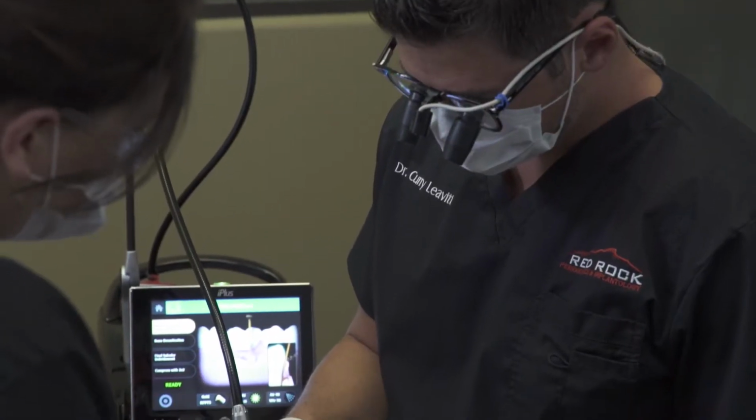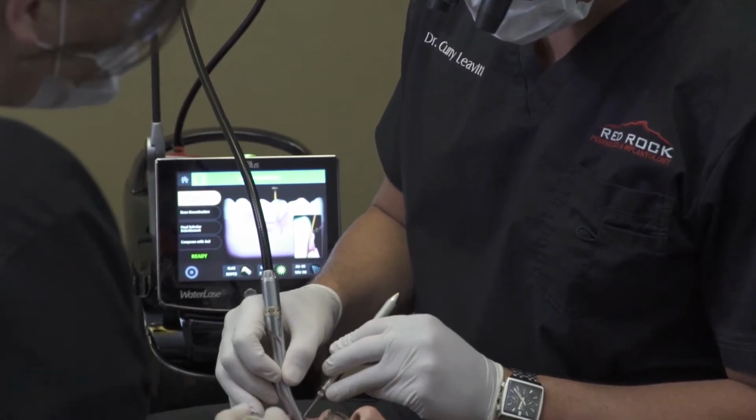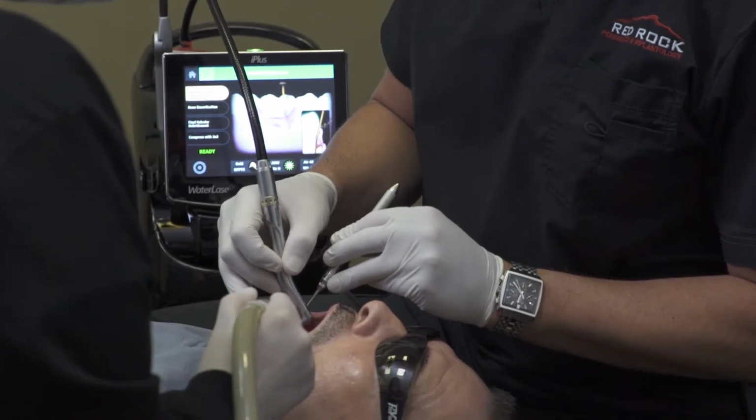better clinical outcomes. So how this laser is used is, one, it's a high intensity laser that vaporizes bacteria that can decontaminate around the tooth and stimulate new bone growth to occur without these invasive procedures we used to do in the past.